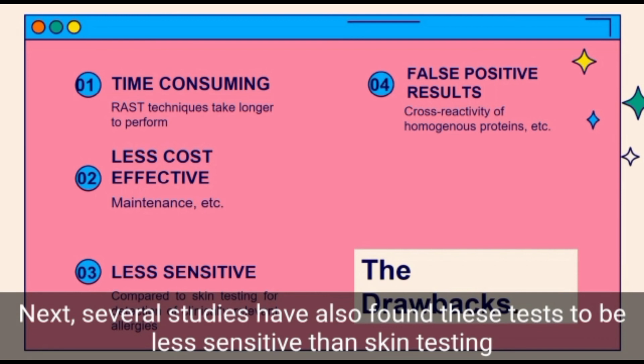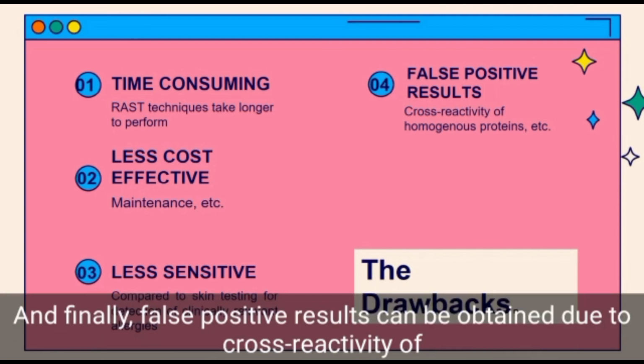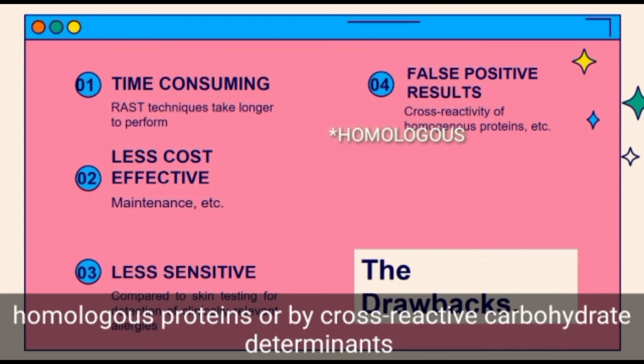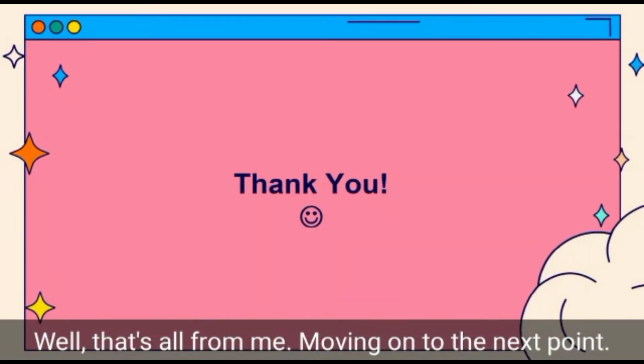Next, several studies have also found these tests to be less sensitive than skin testing for the detection of clinically relevant allergies. And finally, false positive results can be obtained due to cross-reactivity of homologous proteins or by cross-reactive carbohydrate determinants. Well, that's all from me.